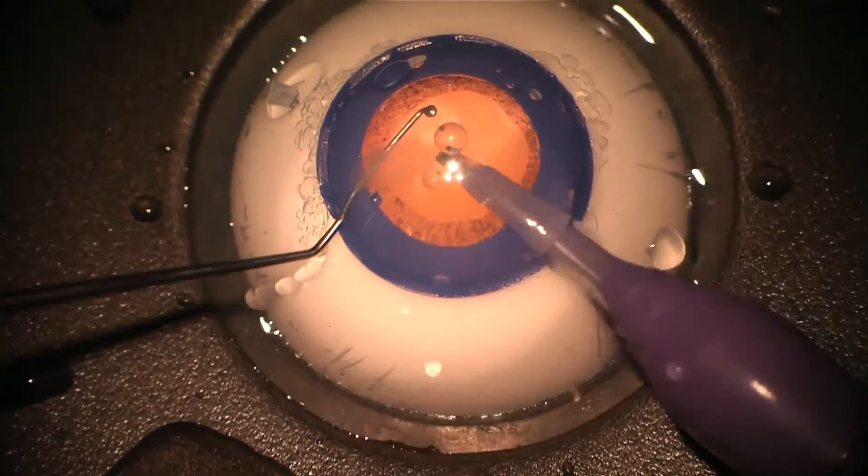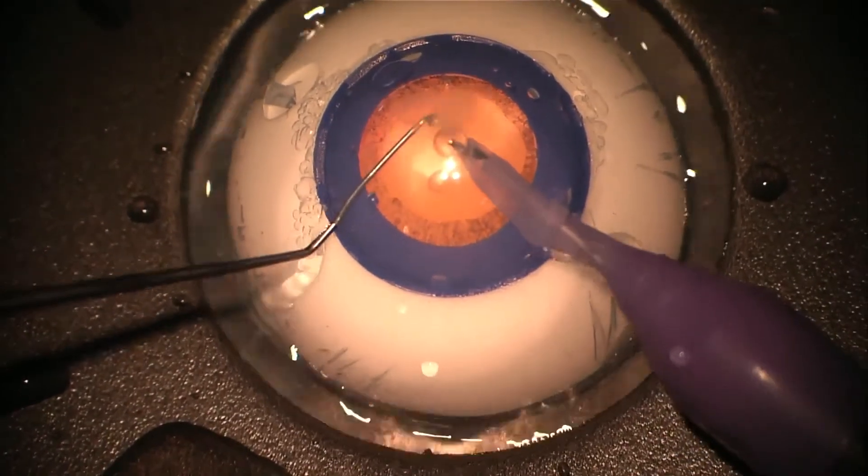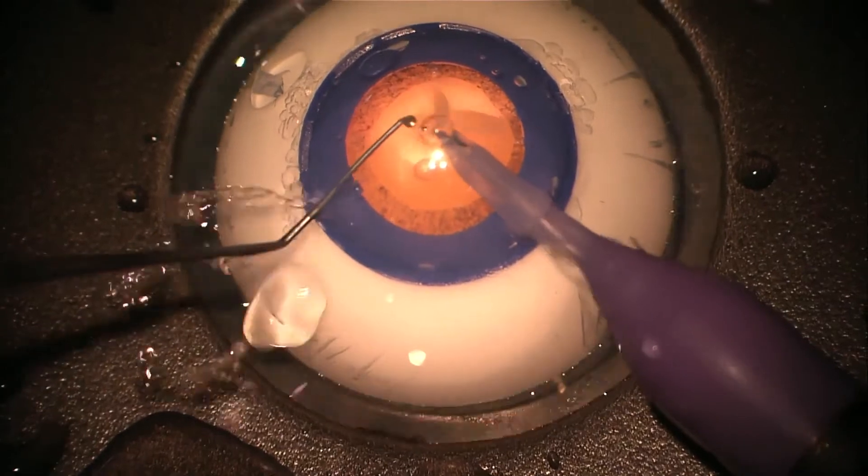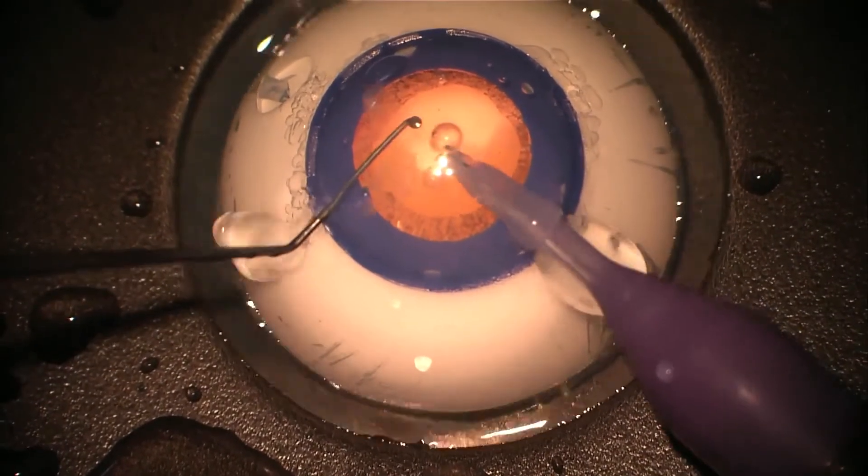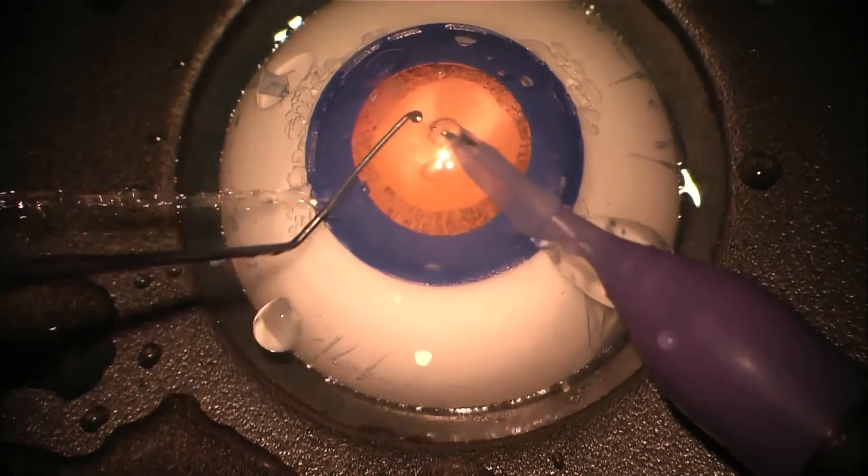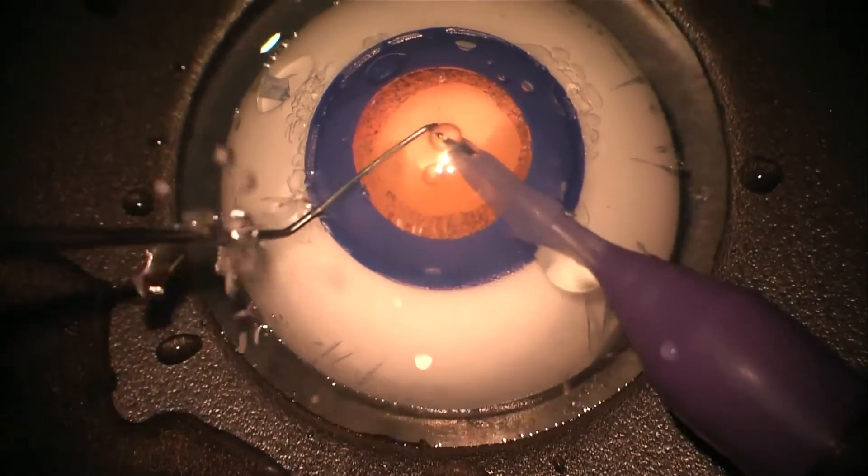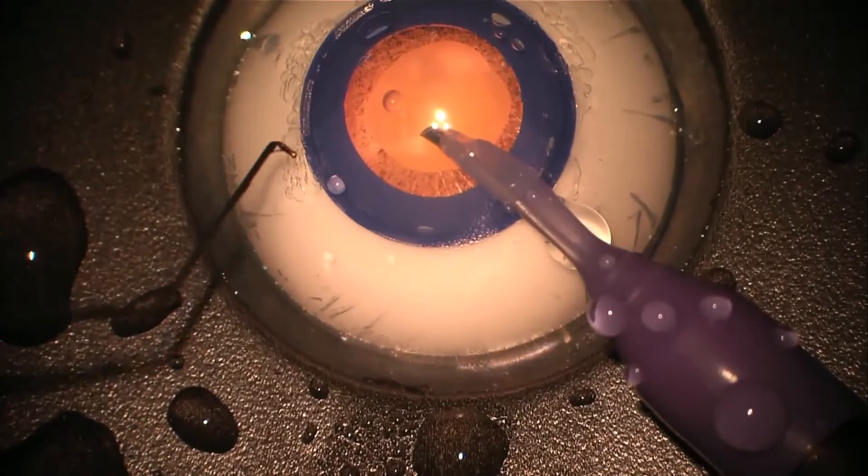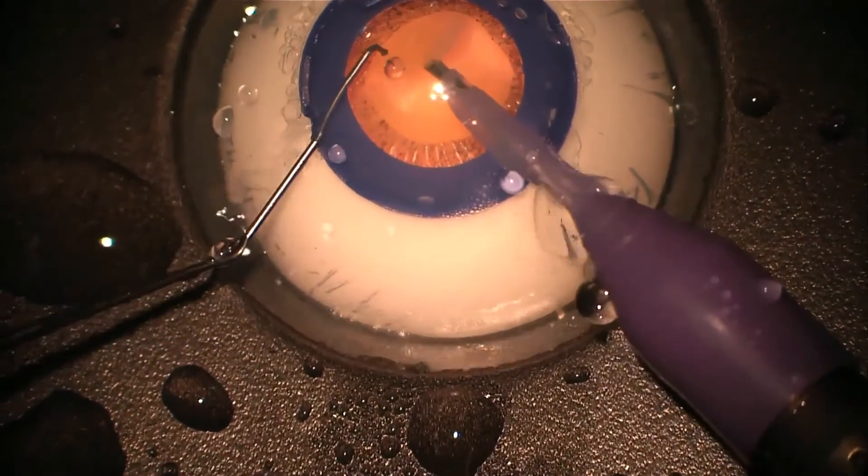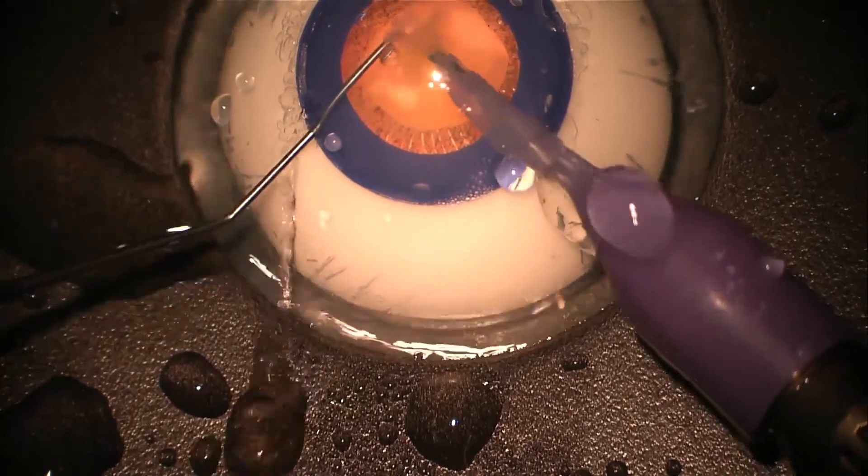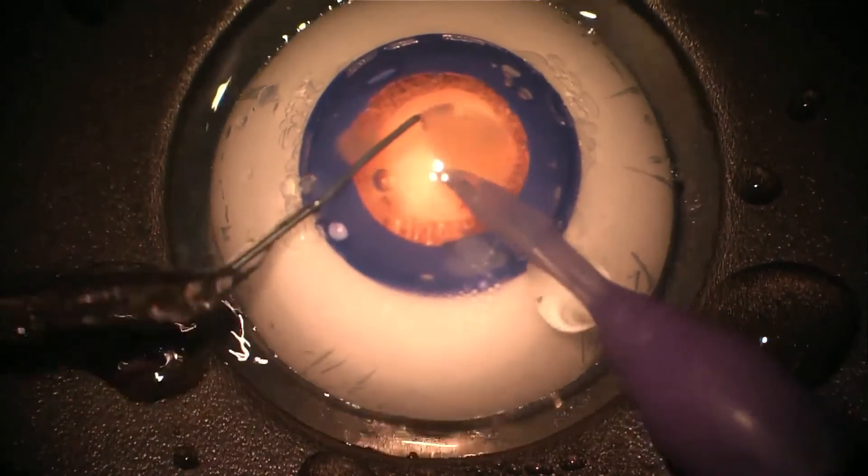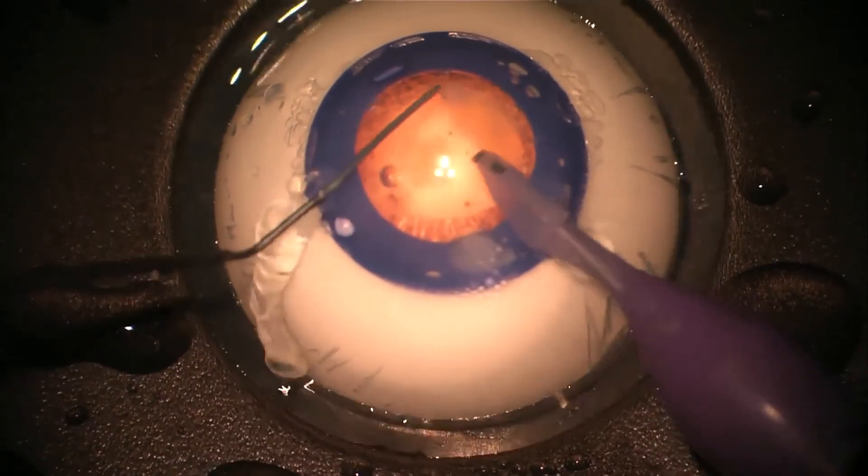The nuclear fragments tend to be slightly lighter, less dense than live lens would be, and so they tend to float slightly more anteriorly in the anterior chamber than normal nuclear fragments. But the principles of manipulating the quadrants using the second instrument and coordinating the use of the FACO tip and the second instrument are all invaluable skills to learn before the trainees progress towards live surgery.